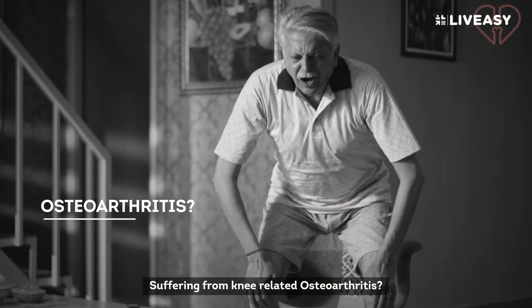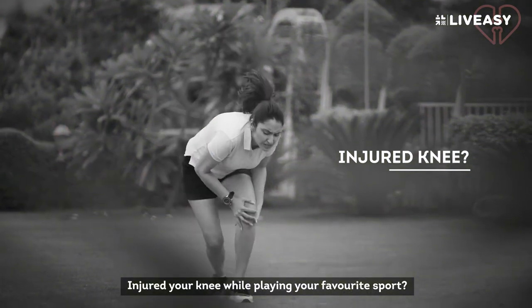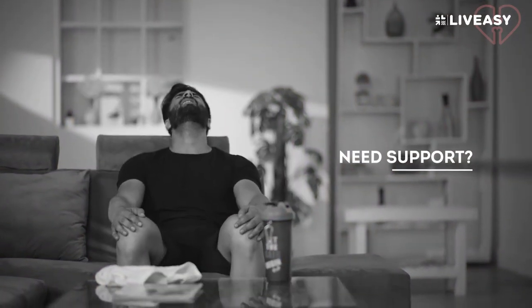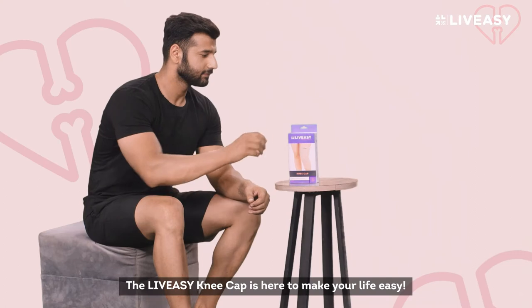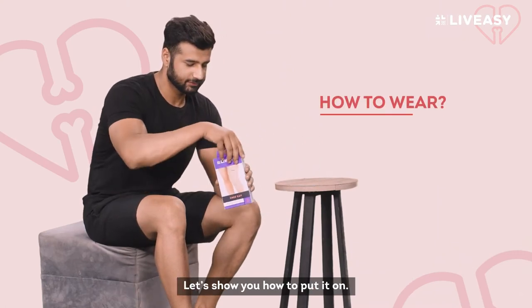Suffering from knee-related osteoarthritis? Injured your knee while playing your favourite sport? Or need a little support after a rough leg day? We've got you! The LiveEasy kneecap is here to make your life easy. Let's show you how to put it on.